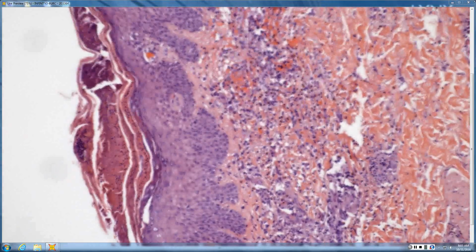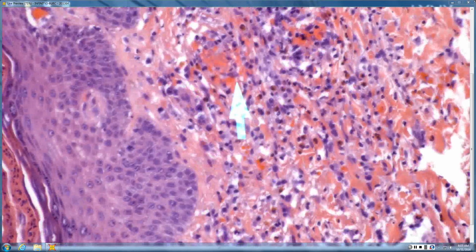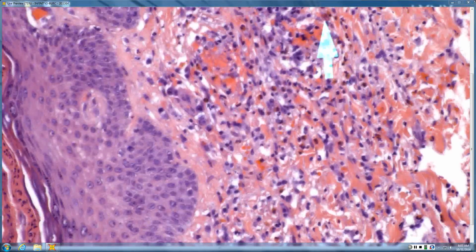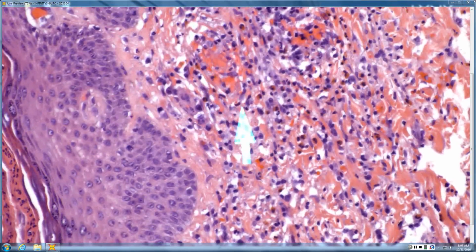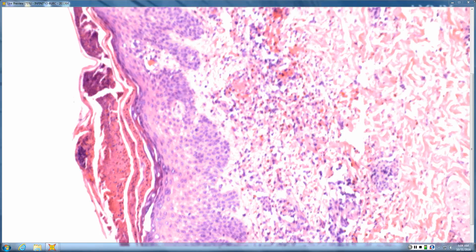And then what do you see? A lot of eosinophils, eos, newts, a little karyorrhexis, not much, but there's vascular damage, right? See all the red cell extravasation? So you have vascular damage out of proportion to the number of neutrophils. Vastly out of proportion. So you got a crust, vascular damage out of proportion to the neutrophils.